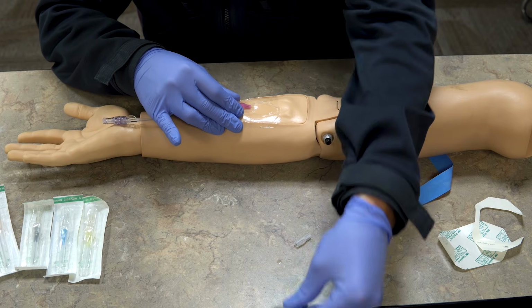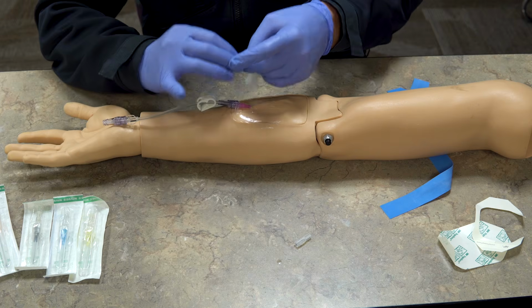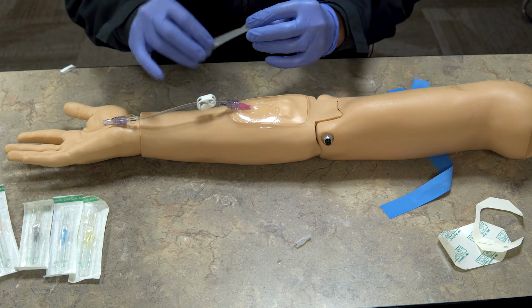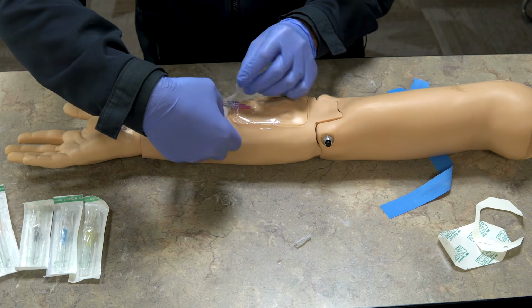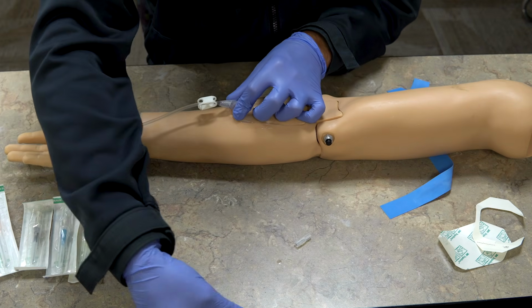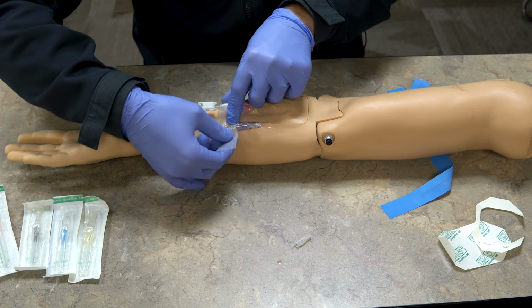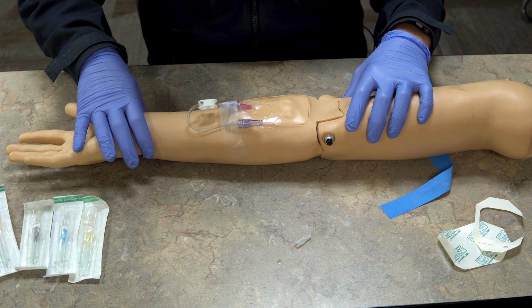And we're going to take that tape we got earlier. So once again, there are a lot of different ways to do this. I've gone through a lot of different things. If it's kind of a life or death situation, I'll just tape over the top. You can come underneath and tape more of a butterfly on either side, just something to secure that. And you want to take a second strip of cloth, take this across, and this is why it's called a loop, because you usually loop it back. And you tape that down just like that.